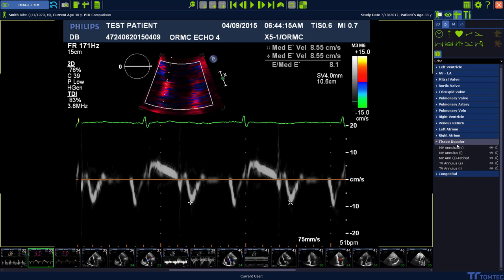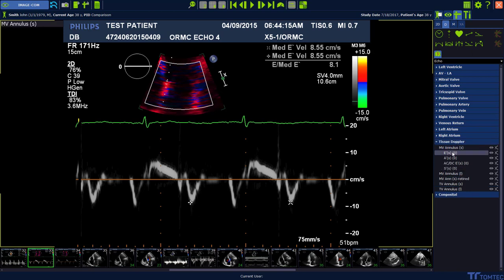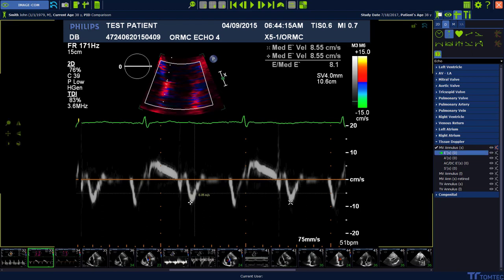Select MV Anulus Septal. Select E' and perform the measurement with a left mouse click on the image.